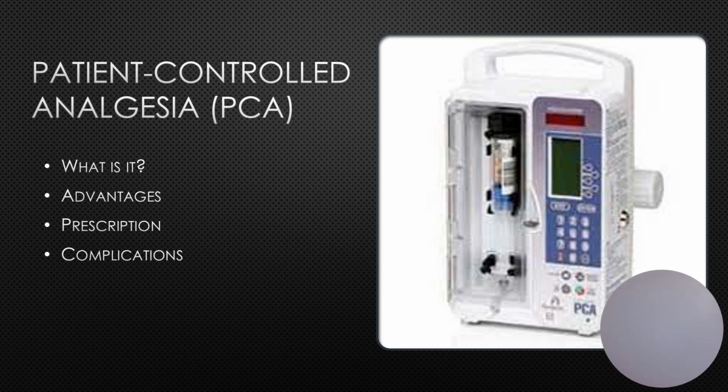Advantages of the PCA: there's no IM analgesia administration. It is individualized pain relief, and there's decreased time between pain onset and medication administration. It provides the client with a sense of control and allows for night sleeping and decreased day drowsiness. Clients may actually require a lower amount of analgesia.